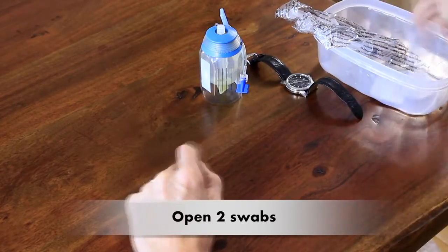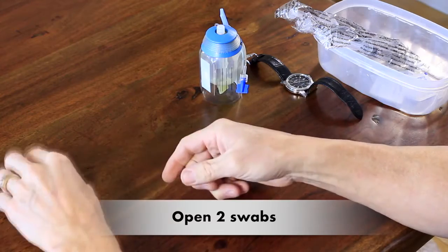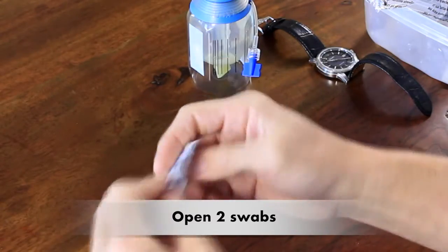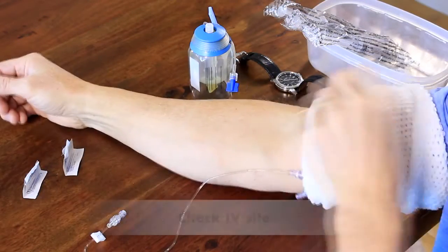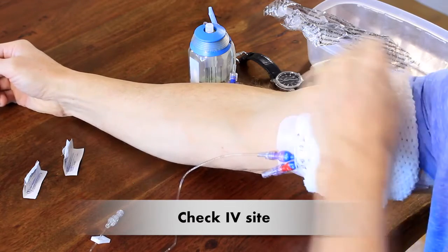So open your swabs. We'd rather not have the alcohol swab touching the table. So you can see that Scott has kind of propped it up by bending it over. What you could do before you open your swabs though is first have a look at your IV to make sure it's okay to use.